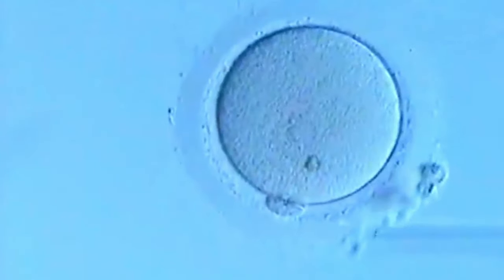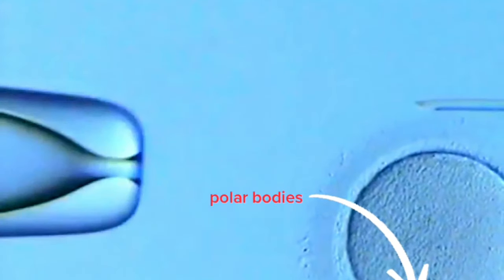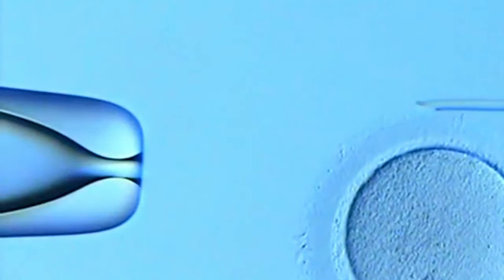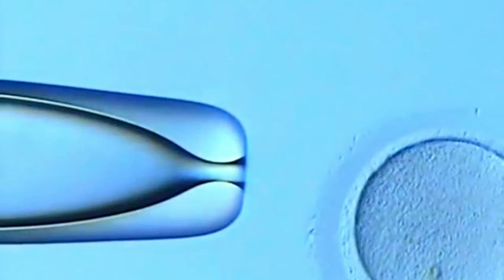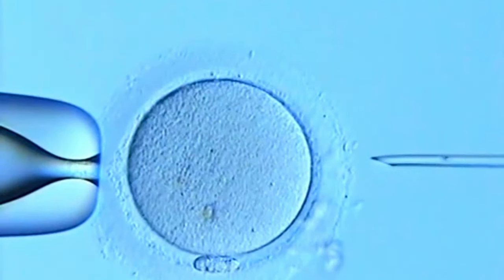Now they're manipulating the egg to get it to where the polar bodies, which are those two round structures at the bottom of the circle, are going to be at least the 12 o'clock or 6 o'clock position. Now that device will hold the egg so that way they can inject it with the needle.